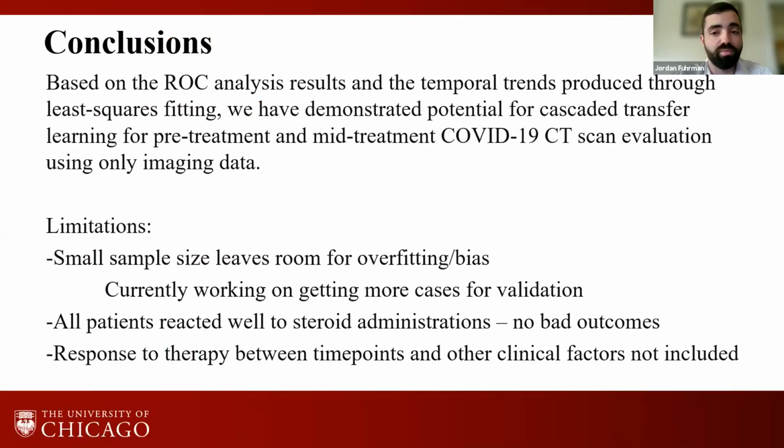So I want to give you a few conclusions for this preliminary study, which was based on the ROC analysis results and the temporal trends produced through least squares fitting. We've demonstrated that there is potential for this cascaded transfer learning technique for both the pre-treatment and mid-treatment tasks that I discussed for evaluating COVID-19 patient CT scans.